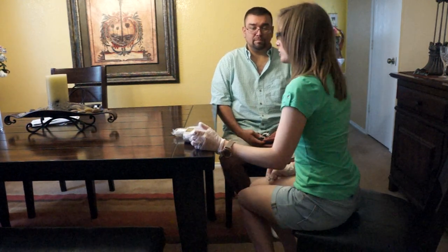Okay, and now before you put those on, I'm going to show you exactly how to do the test, okay? You want to sit up nice and straight in your chair, all the way back to the back of the chair. Good. Feet on the floor. Good. Okay.